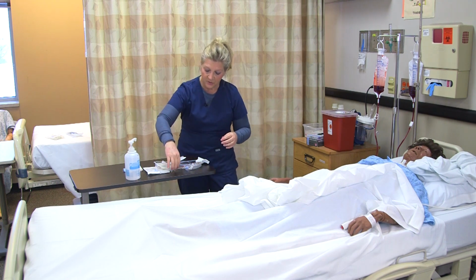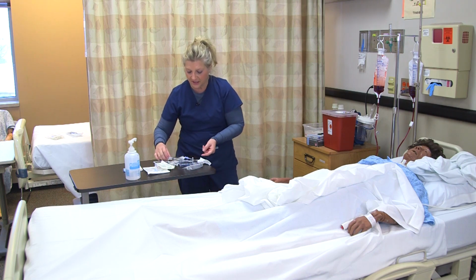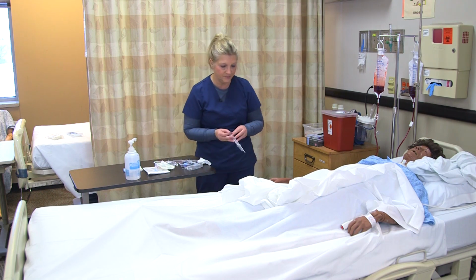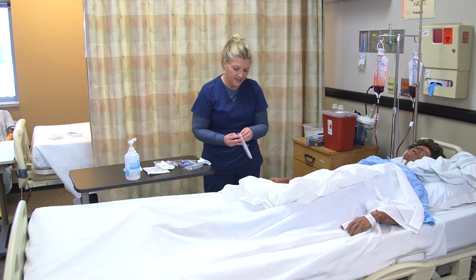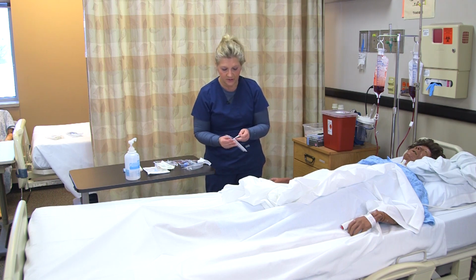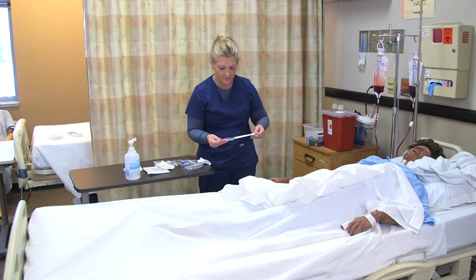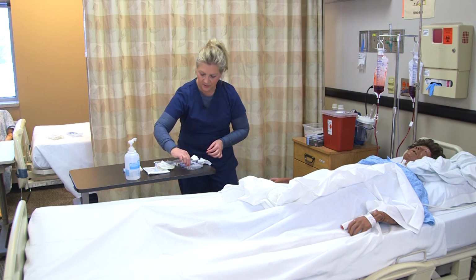And I have my normal saline flush, and I attached it to an extension tubing. The kind of tubing that you're going to use for an extension depends on what type of IV catheter that you're using. So for instance, this one doesn't have an extension built into it, so I need to have a full extension to put on it. So I open that up, okay, and then I get that ready over here.